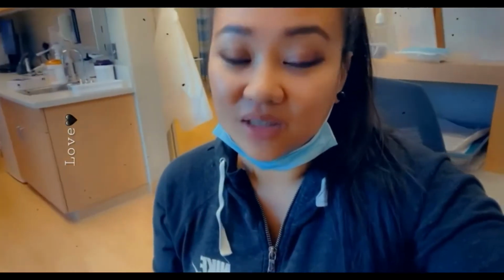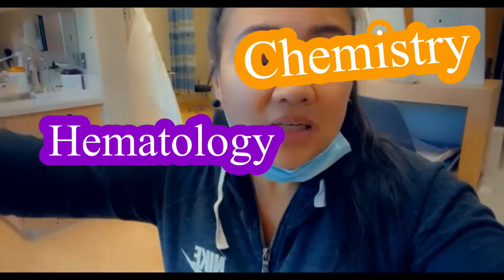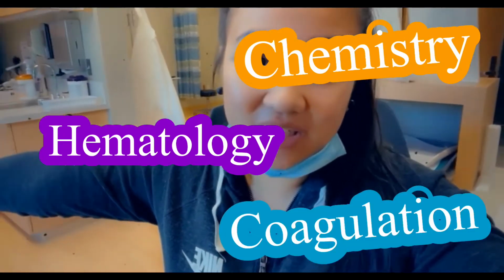just have to know that there's 3 main benches in the lab. Most of the time, it just depends on where you work. There is hematology, chemistry, and coagulation. So usually it wouldn't be a problem for you guys to figure out where the test goes into, like what tube, because if you don't know off the top of your head where it goes, you can always ask somebody. That's the first thing you can do.